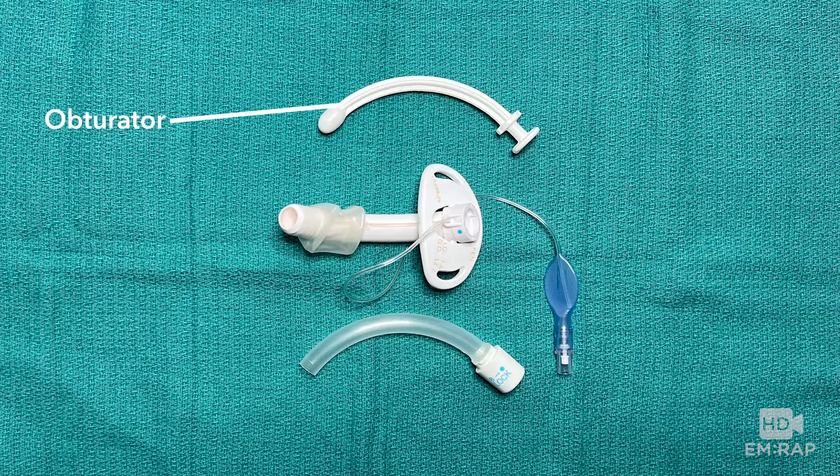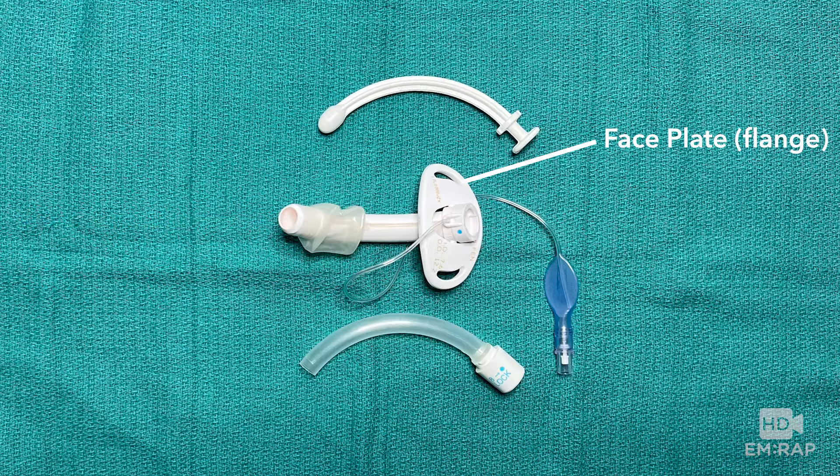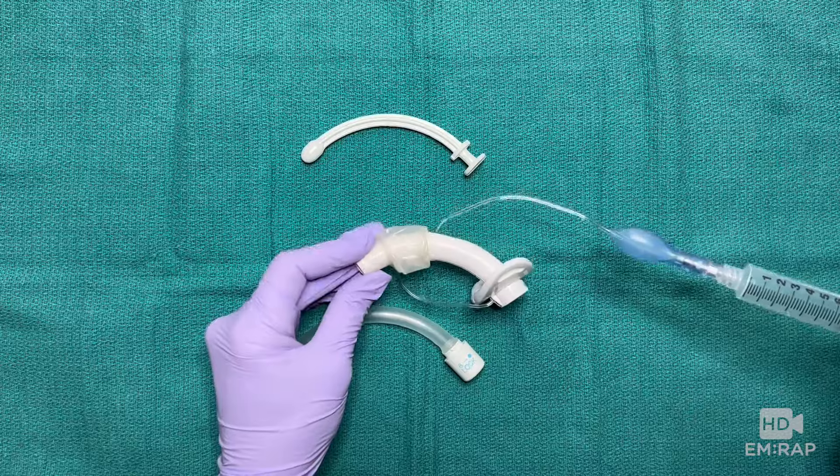It comes with an obturator which slides into the outer cannula during placement, which is then removed, and the inner cannula is placed inside the outer cannula. This is the face plate, also known as the flange.